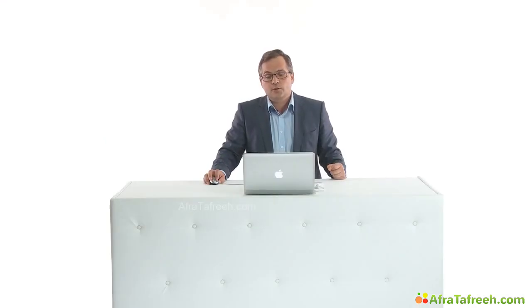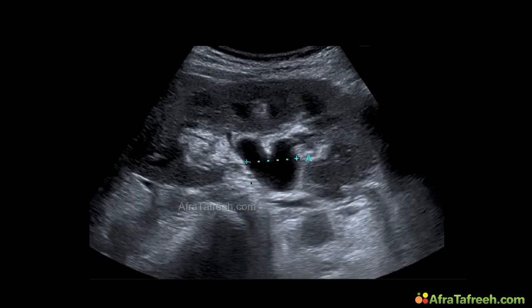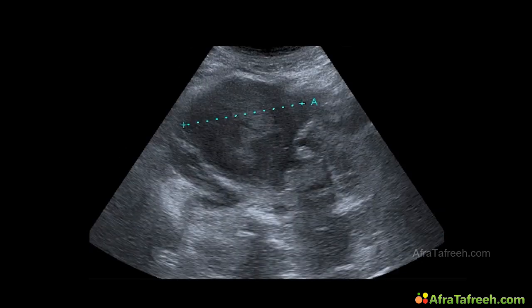A 45-year-old patient is admitted to the hospital and she complains about pains in the right upper quadrant. So we perform an abdominal scan. You detect the liver and the quite empty gallbladder over here. The IVC in the far field, but no gallstones are seen, so we proceed scanning. So we detect the right kidney and we can see a dilated urinary tract over here. So the diagnosis of hydronephrosis is made and we proceed with the scan of the lower abdomen.